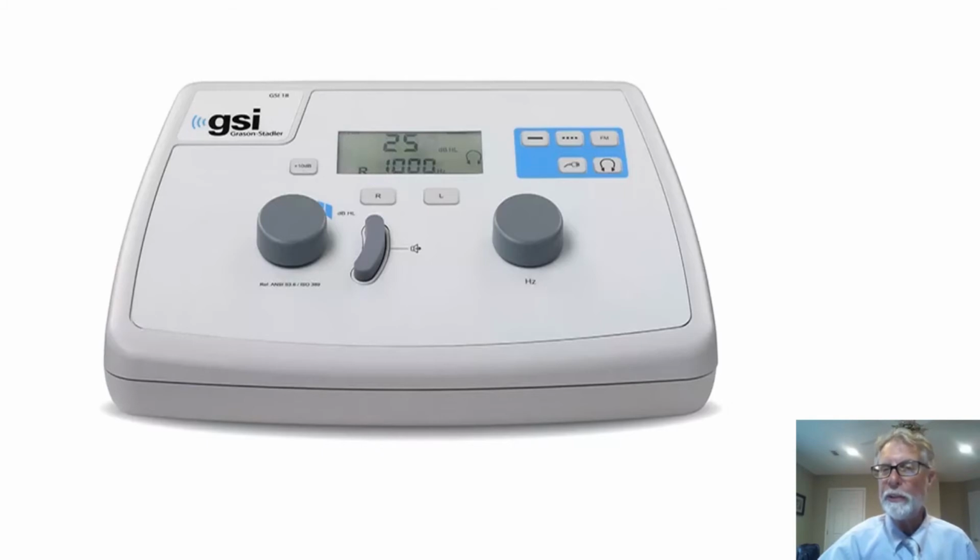It's usually easier to hear a pulsed tone than a continuous tone, especially when you get down close to threshold, the lowest level that a patient can respond to. That's their threshold. And so a pulse tone is a very good thing to use. I would advise that a pulse tone is always used, and give them at least 3 beeps. There's usually a light on the display showing you that a beep is being applied. You'll see it blinking.